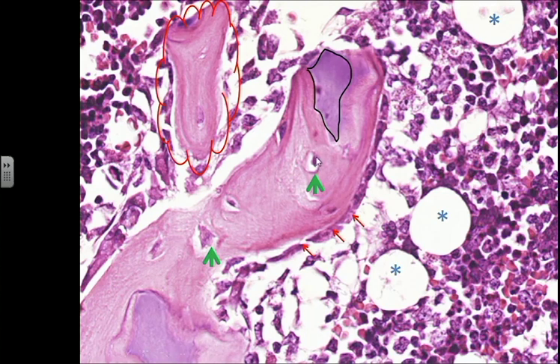So we spoke about osteocytes, osteoblasts, and bone matrix. That's pink. In children, we can have a cartilaginous remnant that's purple within the bone spicule. When we go further and leave the bone spicule and go around in the milieu in which these bone pieces are present, we find there are a lot of purple dots.